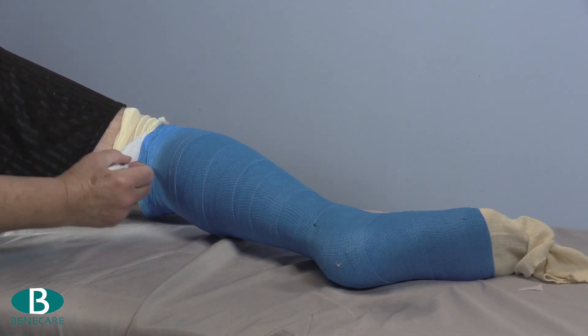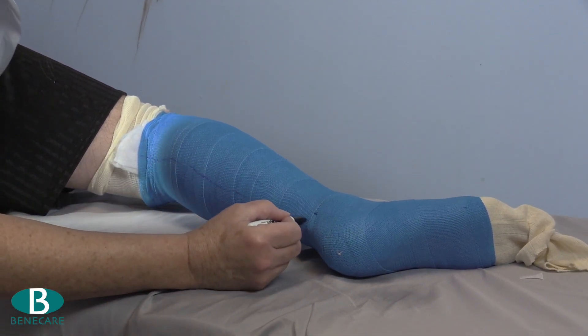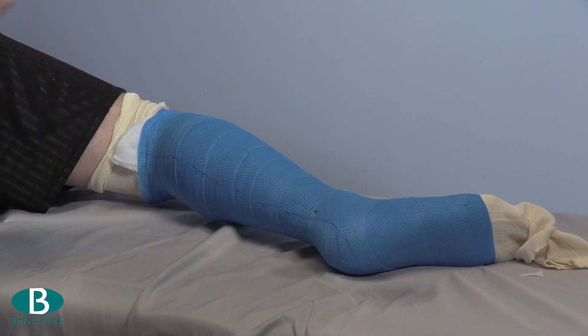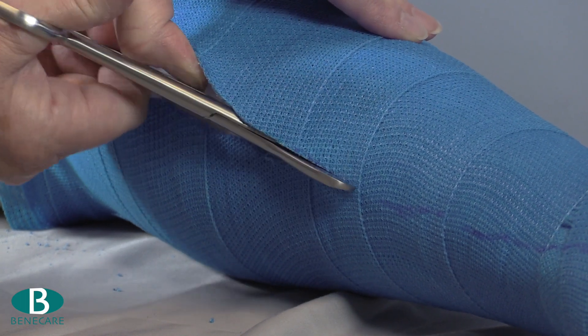Allow the cast to reach the initial set and rest on a soft pillow. Mark the cast along the posterior aspect with a J at the heel. Using bandage scissors or nibblers, cut along the template.